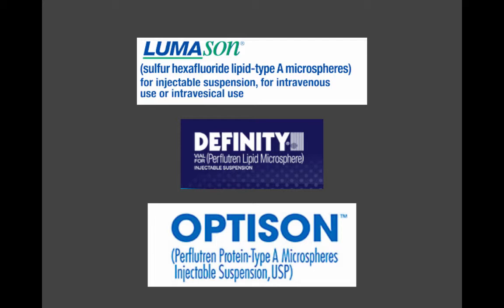They are being used more and more in emergency departments, particularly in Europe and some places in the United States. Probably the most common use scenario in the ED is, at least in trauma patients, particularly pediatric trauma patients. It can be really, really helpful to diagnose solid organ injury without CT.